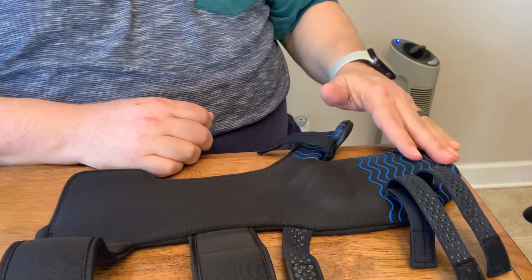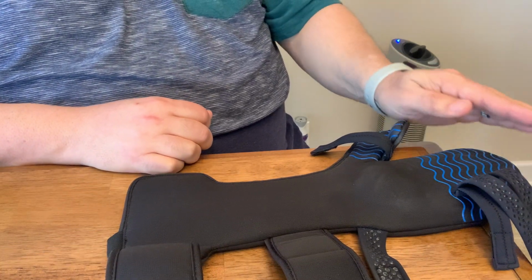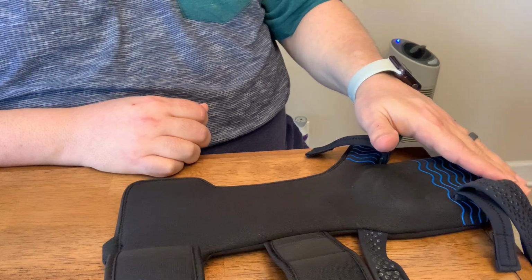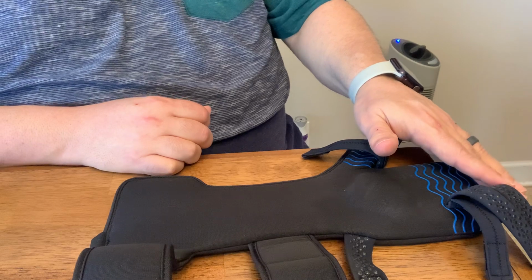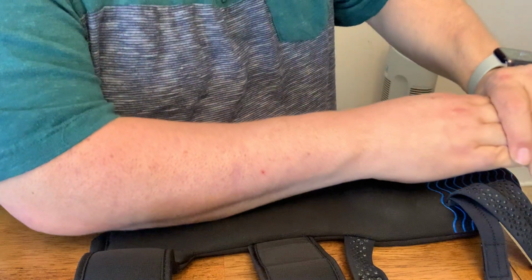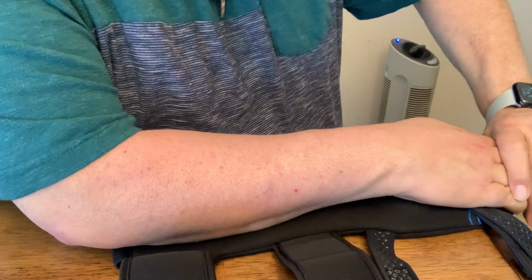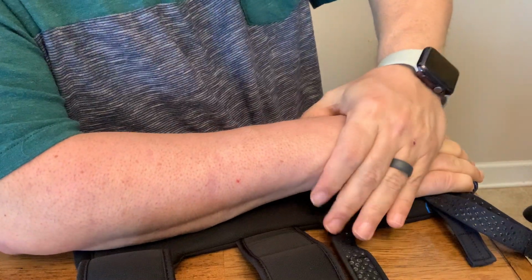So I put this right to the edge of the table, maybe a little bit further, so if my fingers bend, I can bend with it. It has like a plate in here that lets my hand bend because it's going to fight me. You ready? So you take your hand and lay it, and use the edge of the table to bring your fingers up. Hold your hand down.